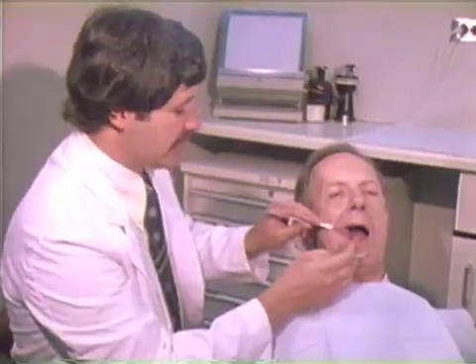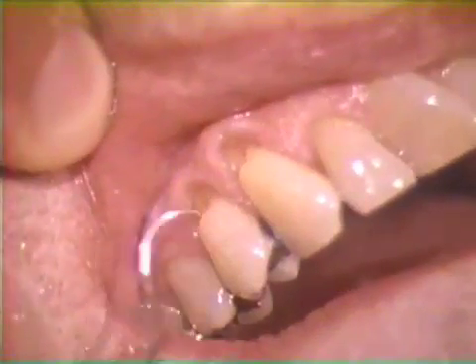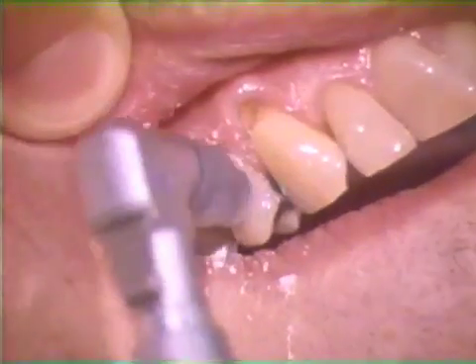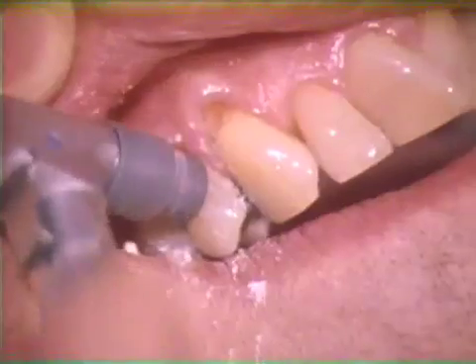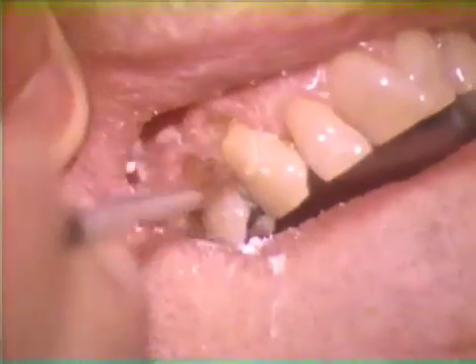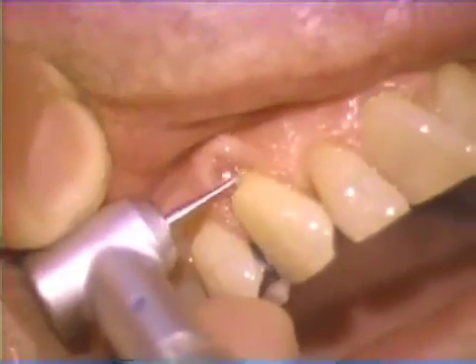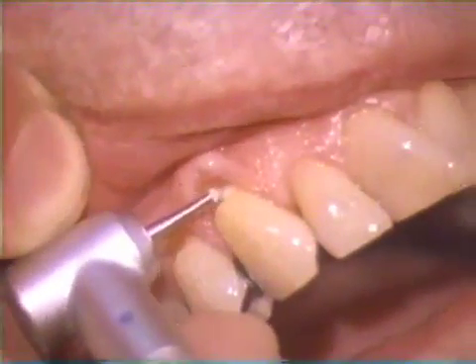Another application for the glass ionomer restorative materials is for the restoration of cervical abrasion. The glass ionomers are ideal for these situations since little or no preparation is necessary due to the chemical bond to dentin. Because the procedure relies upon a chemical bond between the glass ionomer and dentin, the dentinal surface must be thoroughly cleaned with a slurry of fine pumice and water. Pumice preparations containing glycerin and flavoring agents must not be used or bond impairment might result. The area is then copiously rinsed with water. The only preparation necessary is the removal of caries and any unsupported tooth structure; no mechanical retention is necessary.